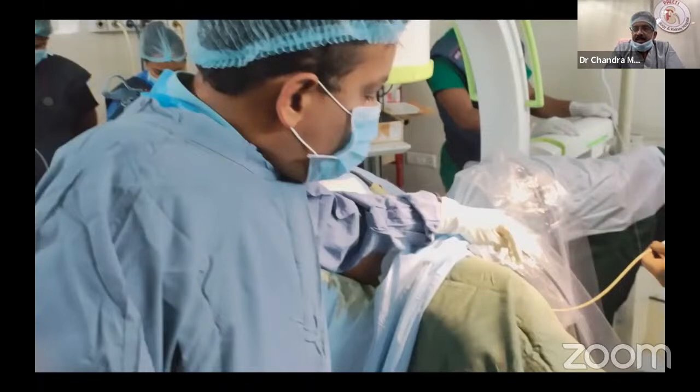So this is a point we want to mention here, that if the ureter is kinky and not straight, and the ureteric catheter is not going up to the stone, and the ureter is not very wide, sometimes you can take the decision of supine PCNL in the same position. But the only thing is, consent should be taken for both. If the consent is not taken, you have to put a stent. If you have told only about RIRS, we have to go for stenting and try later on.